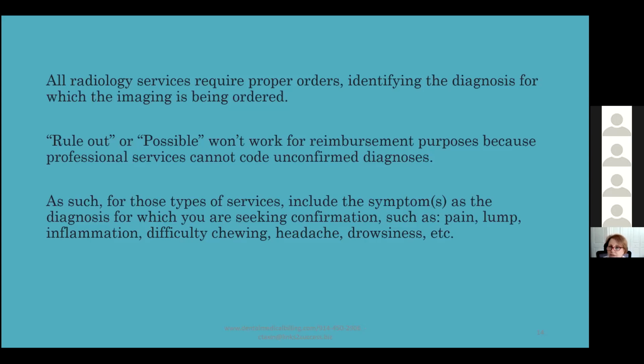And so a medical doctor that's doing a clinical at that point, well, he doesn't have X-ray vision either. He may know in his mind, maybe it's a fracture or maybe it's the meniscus, but I don't know for sure. So I'm going to order a CBCT scan or an MRI or an X-ray so I can help diagnose this patient to the fullest extent.